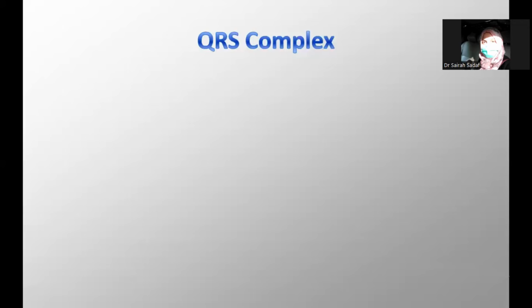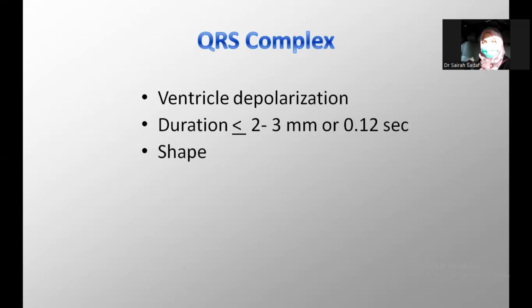Now about the QRS complex, an important part. First of all, tell me what the QRS complex represents, Amna? Ventricular depolarization. Yes.